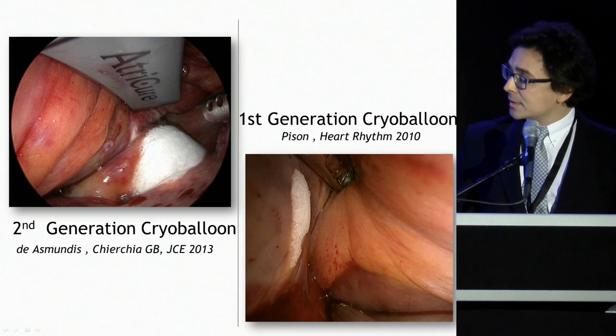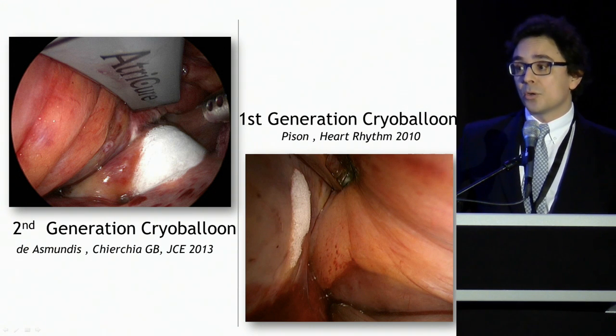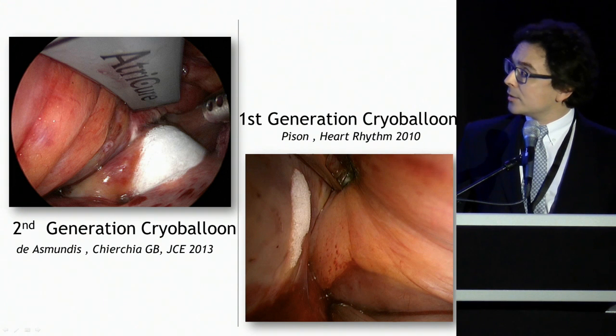And what you see is this extracardiac ice formation. If you really look very closely, you will see that there's this little whitish area. So hypothetically, this is probably the area where the jet was touching the wall of the PV. And these were areas of suboptimal lesion, which probably were more prone to reconnection later on.